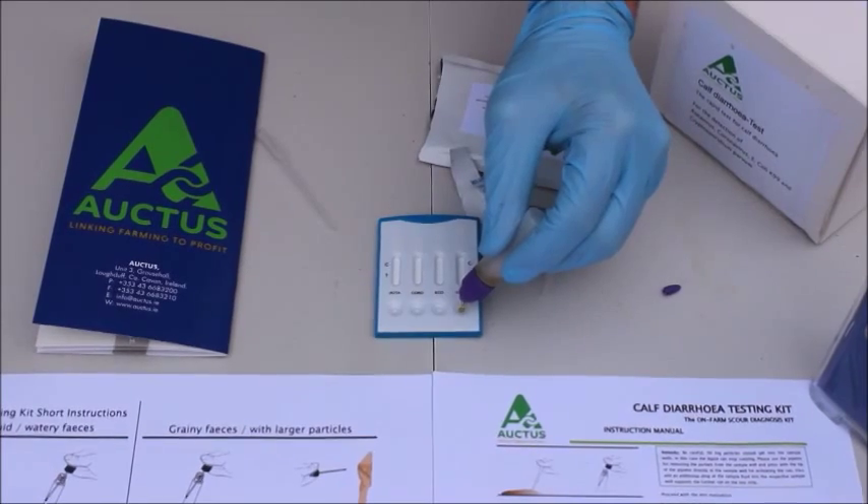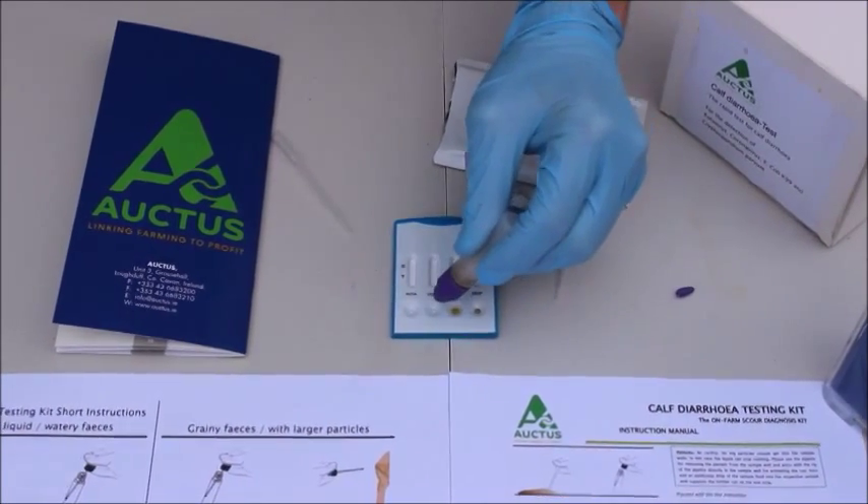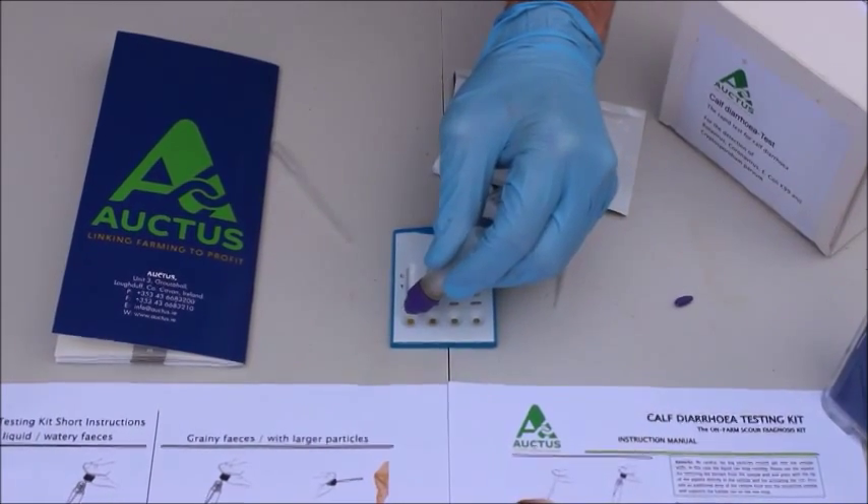This is then testing for cryptosporidia, E. coli, coronavirus, and rotavirus.